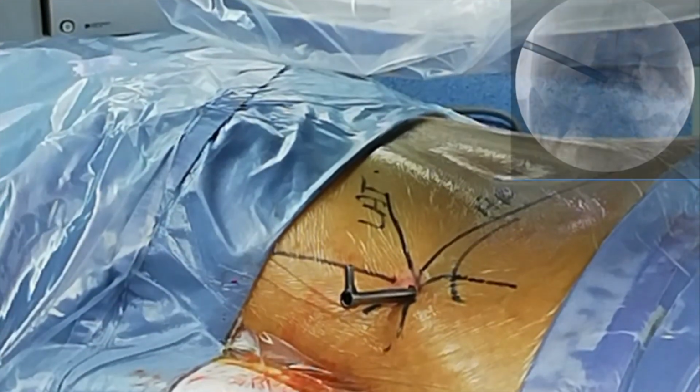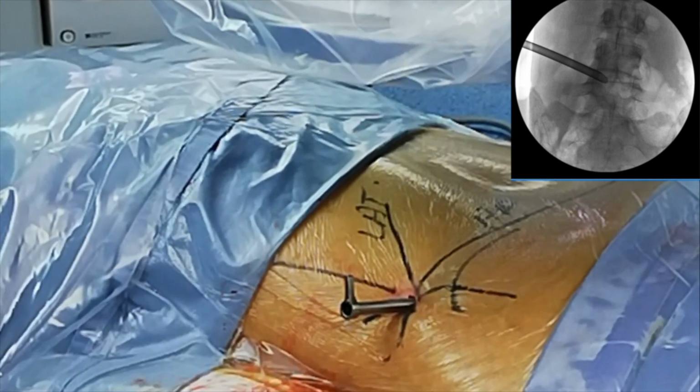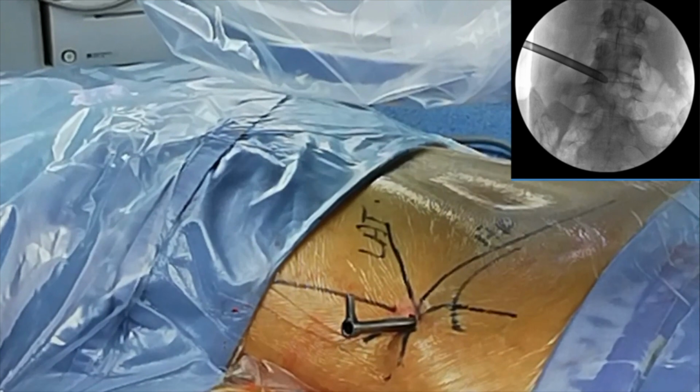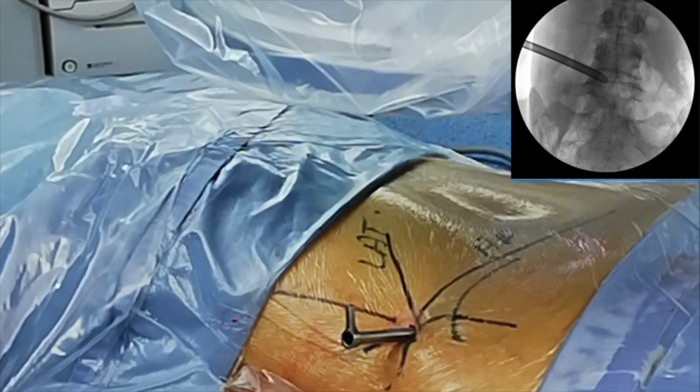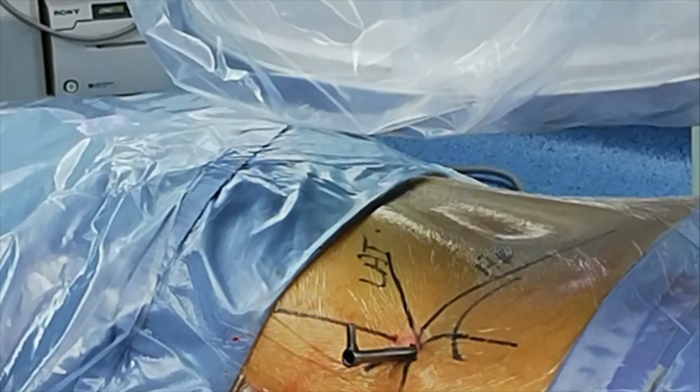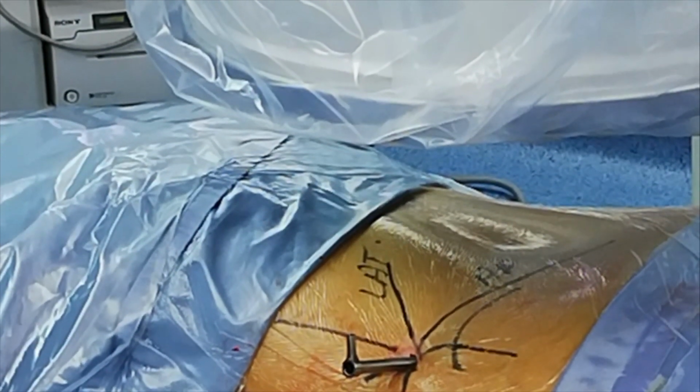X-ray, please. Now this is important. So my cannula tip is at the level of the medial pedicle wall of L5, so I know that I am actually in the recess. Give me a quick lateral view, and that will be the last X-ray for this procedure.